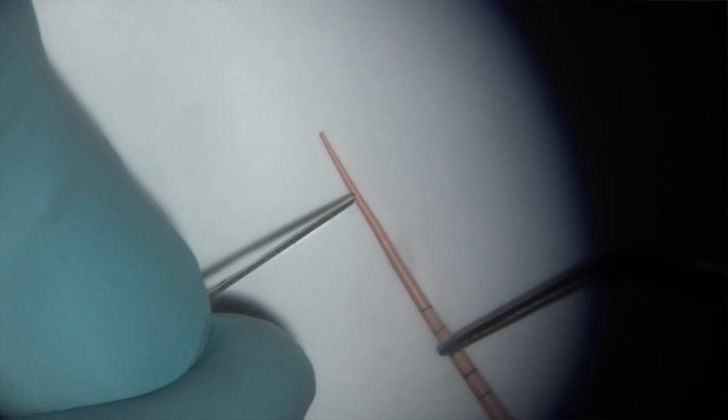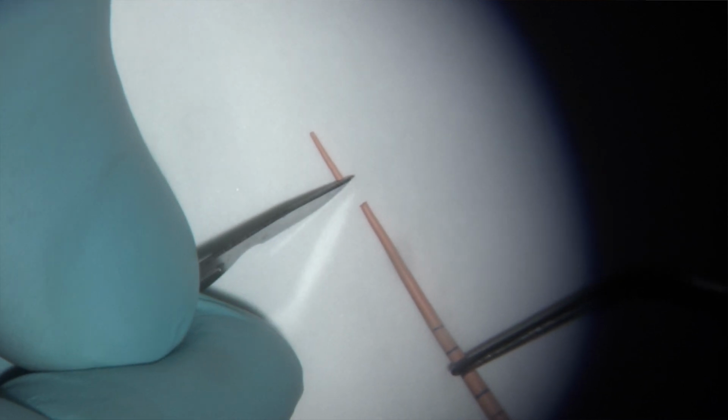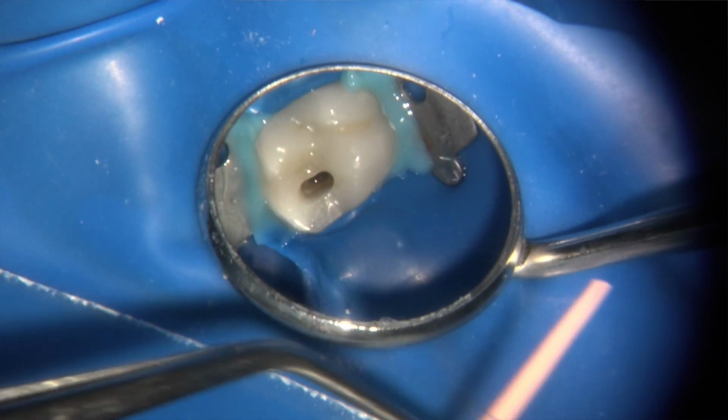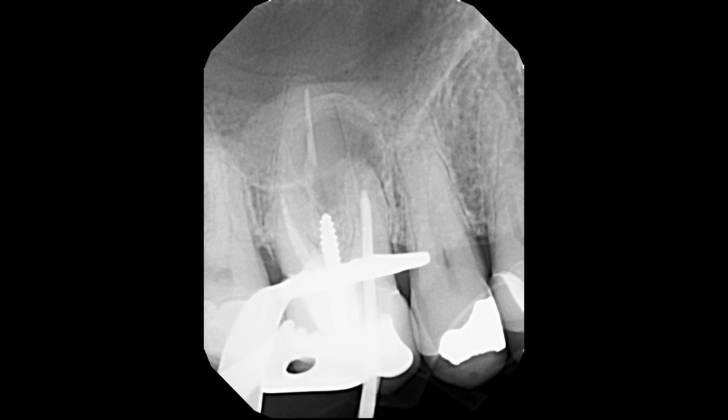Okay, so now I want to talk to you about the technique for doing what I just talked about, which is a non-surgical retrofill. The idea is once I have fitted these cones to the apex, I'm going to remove about 4 millimeters from the apical portion of these cones. As you can see here, I'm using the scalpel to cut off the last 4 millimeters of this fitted cone to the apex. Then, as you can see, when I put it back inside the canal and expose another radiograph, we have 2 custom fit pluggers that are about 4 millimeters short of the apex.